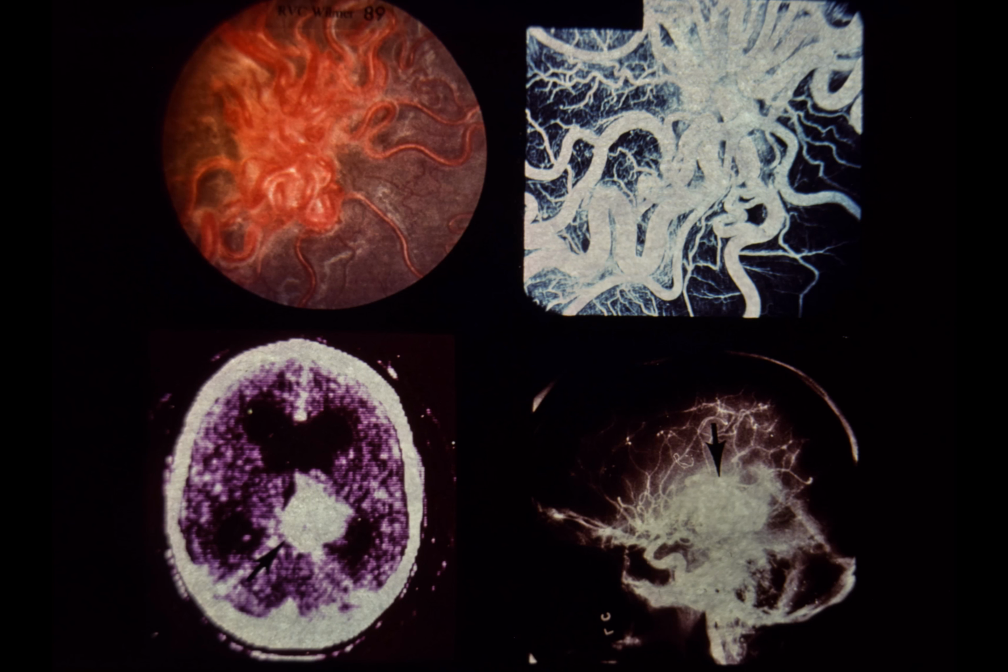Upper left. The right optic disc is obscured by a network of enlarged abnormal vessels that extend into peripheral retina. Upper right. A fluorescein angiogram shows extensive arteriovenous communication, but no dye leakage. Lower left. An EMI scan shows moderate hydrocephalus. In the region of the left thalamus, a large mass extends into the left lateral ventricle. Lower right. A cerebral angiogram demonstrates a large vascular malformation fed by both middle cerebral and posterior cerebral circulations.